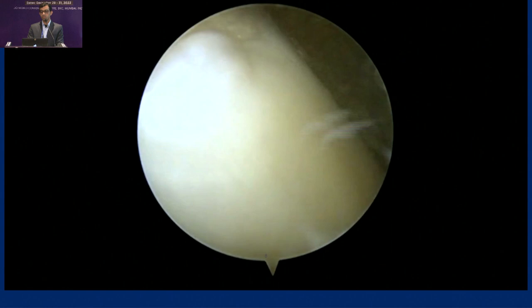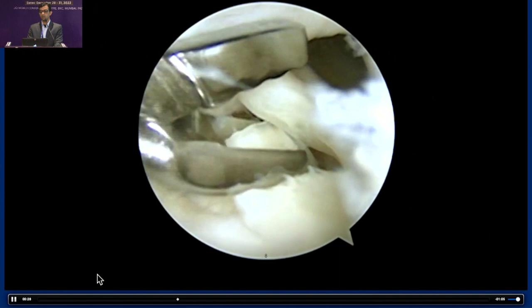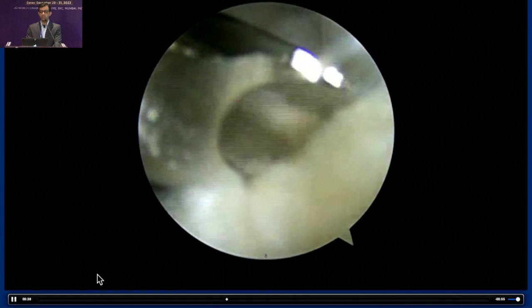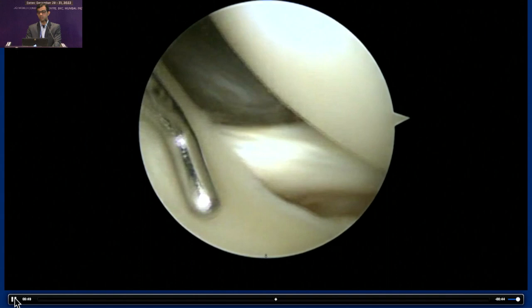Start resecting the meniscus from the anteromedial portal. You may need to change the working portal to the anterolateral portal. You should have right and left arthroscopy punches as well; it will save time. Routinely debride the infrapatellar fat pad to get the vision properly. See the peripheral attachment onto the under surface as well as the over surface of the meniscus. This is the popliteal tendon.